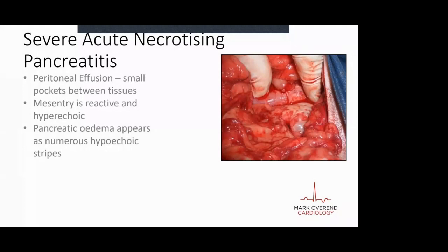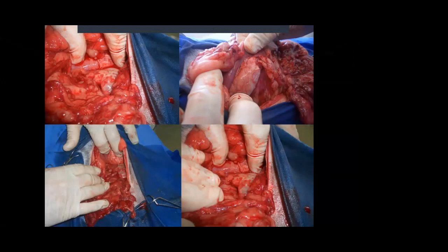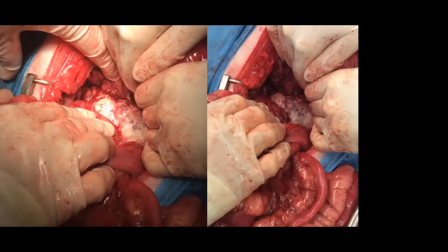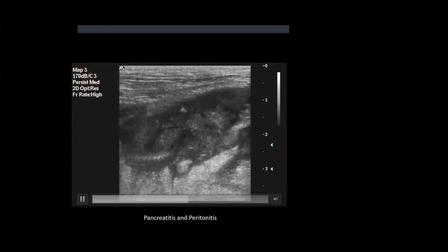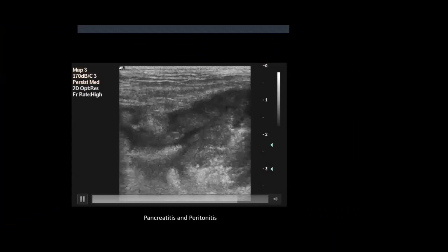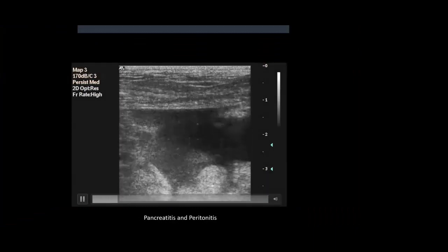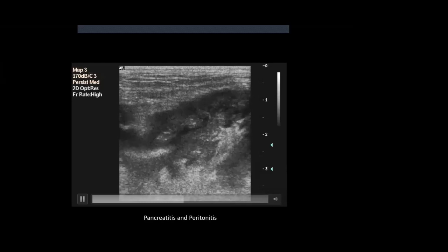We also see cases of severe acute necrotizing pancreatitis - these look like this and tend to have an effusion around them. It's a more severe version with much sicker patients. The mesentery is very reactive and hyperechoic, and you get pancreatic edema as numerous hypoechoic stripes. Here we have some free fluid around the abdomen, and you can see the pancreas just coming in here - free fluid around it. This is a nasty, horrible severe acute pancreatitis.